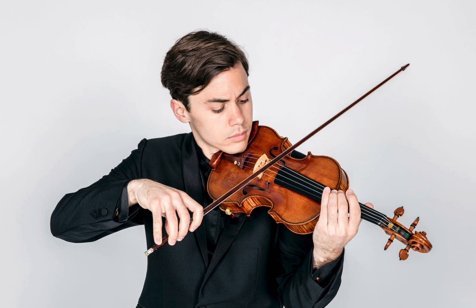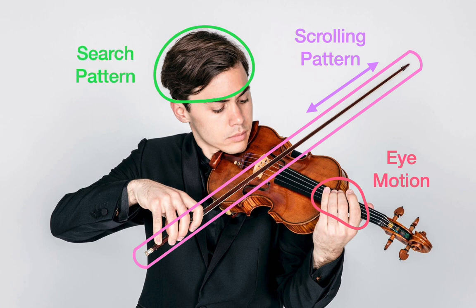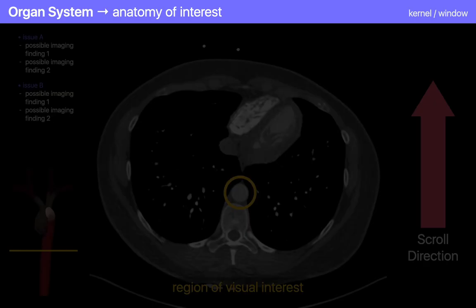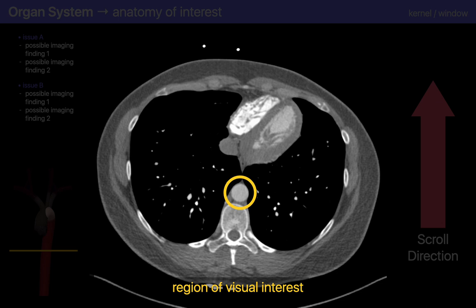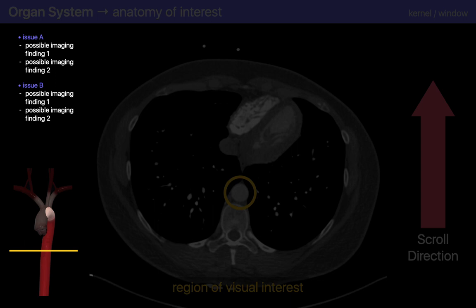I like to compare the reading of a CT to a violinist playing music. Playing a violin requires bowing motions with the right arm and finger motions with the left hand, coordinated by a musical score in the violinist's head. Reading a chest CT requires mouse scrolling motions and eye motions, coordinated by a search pattern and medical knowledge in the radiologist's head. In the demo slides, the colored header bar shows the organ system on the left and the kernel and window settings on the right. The CT image is in the middle with my visual gaze highlighted in yellow, scrolling direction in the right panel, and my thinking in the left panel.